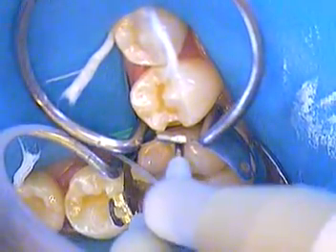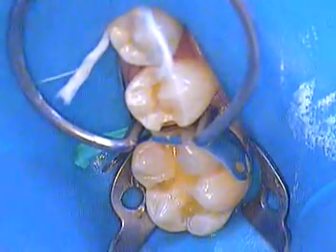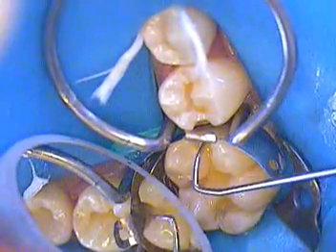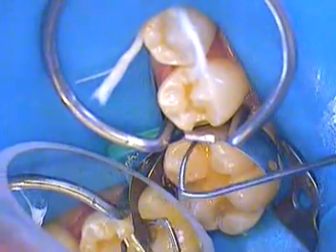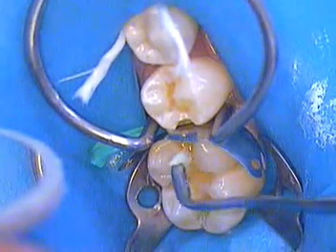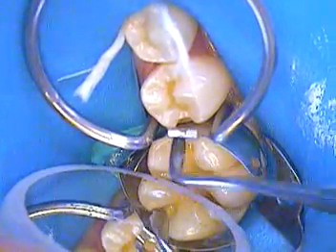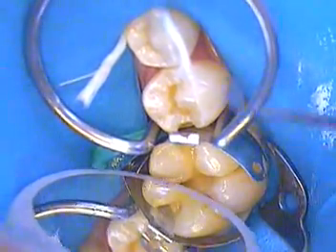I'll use an explorer — just going to spread that a little bit down into that area, mesially and distally. I don't want to skimp here. It's like a wetting agent, that's all it is — flowable — so you don't pack air in there. Come up right against the band, pushing mesially, distally, and then buccal-lingually. This is a Hollenbeck instrument.